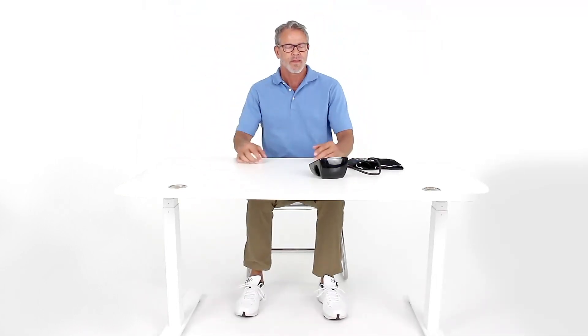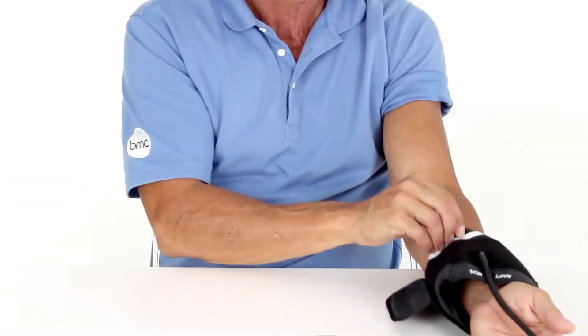For clinically accurate results when using a blood pressure monitor, take a seat and be sure that your feet are flat on the ground, not crossed. Have a flat surface in front of you that you can rest your arm on.